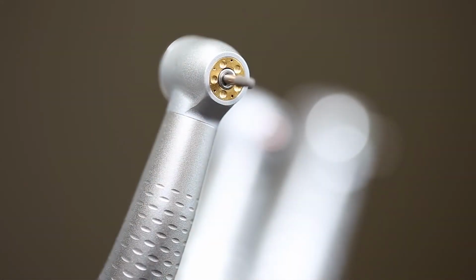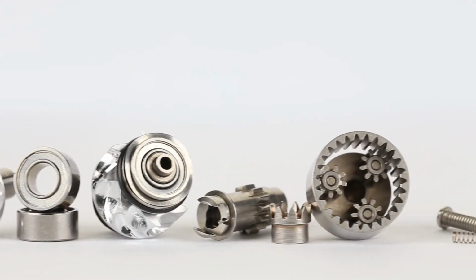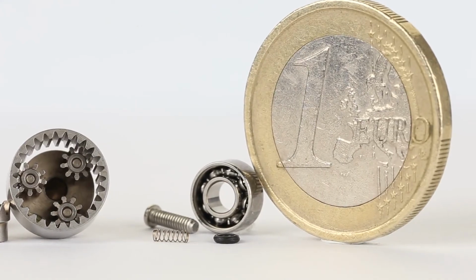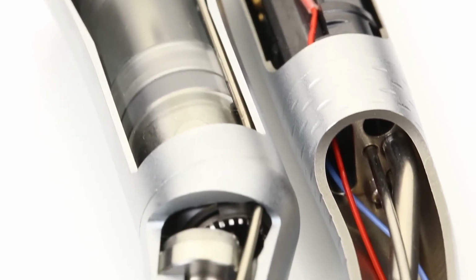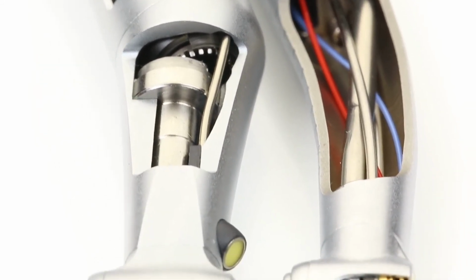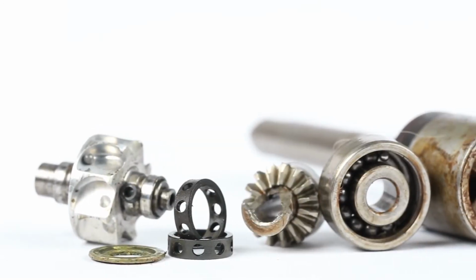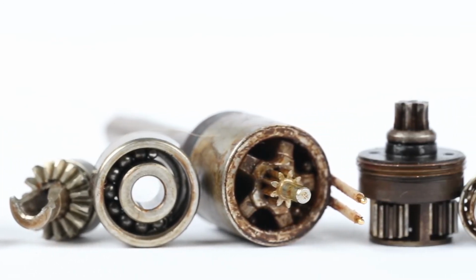Both turbine handpieces and contra-angle handpieces are precision instruments which have to resist extreme pressures, not only during handling, but also through the hygiene and maintenance process required. Inside these instruments are high-precision ball bearings, gears, fiber optics and bulbs, electronics, air and water filters, and seals, which can only work properly if they are cleaned and maintained correctly and regularly. Insufficient lubrication also leads to a faster wear of the rotating parts.